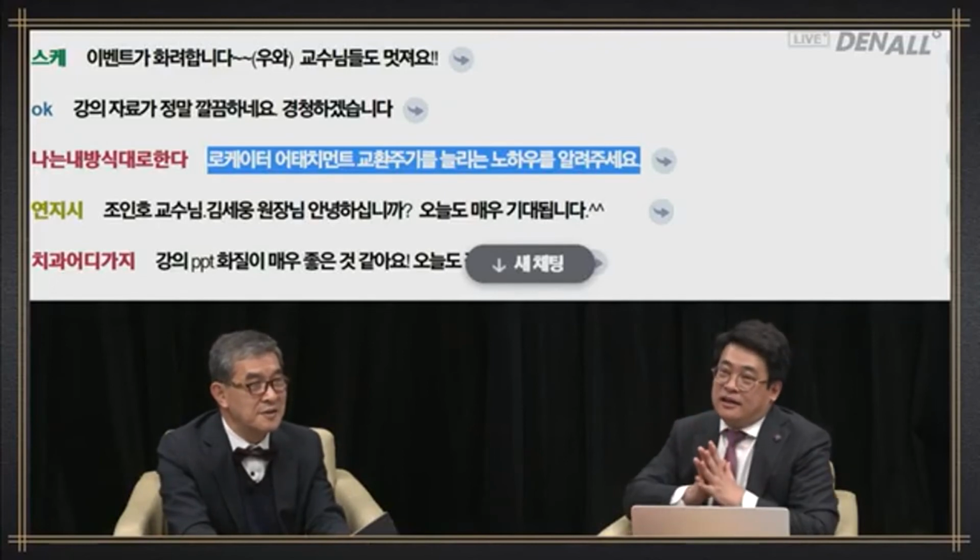At the mental foramen, there's no anatomical restriction, so you can place it in a parallel way. However, clinically, at times it is tilted. In those cases, we can use angled nylon male, and in TS port, angled option exists.